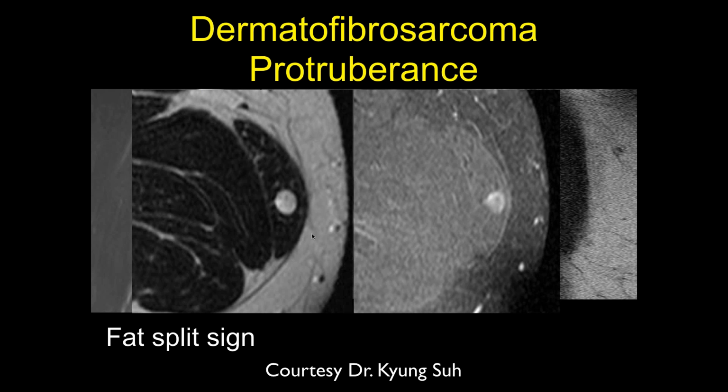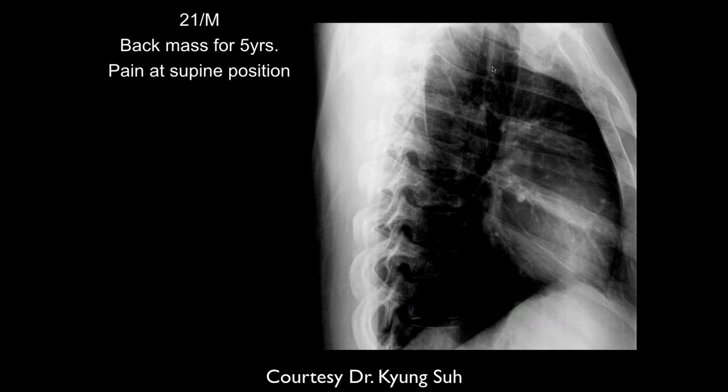And this was dermatofibrosarcoma protuberans. Okay. Most of the ones I've seen have been more in the skin, and they actually protrude out, a firm mass. But these are actual sarcomas, though they don't have as high a metastatic potential as a lot of other sarcomas, but it really needs to be treated as a sarcomatous lesion. So we can now go to the fibrohistiocytic.